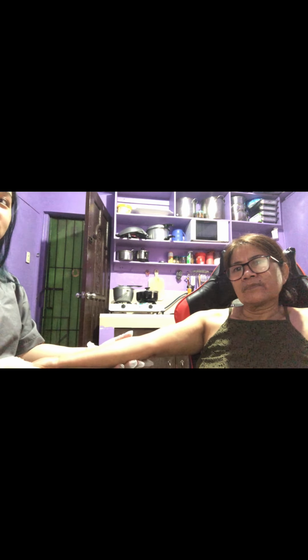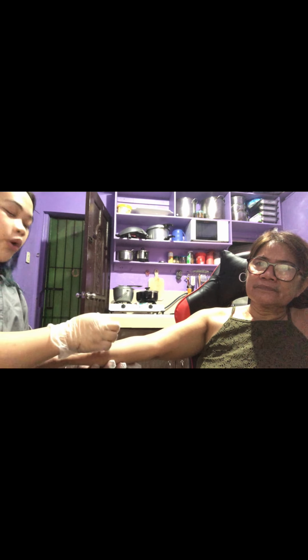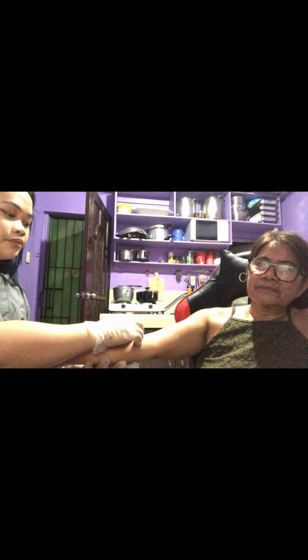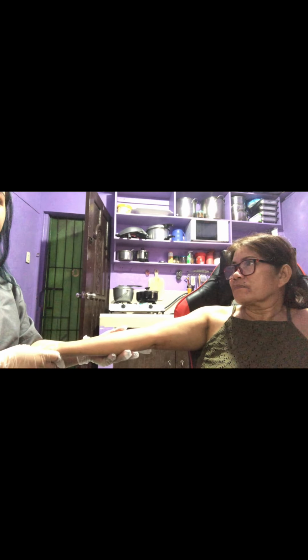So now expose the site of injection. Carefully choose an area away from the blood vessel. Disinfect the site using an alcohol swab in circular motion, working from inner to outer direction. So next, place your non-dominant hand under the patient's arm and stretch the skin out. This will tauten the skin, allowing the needle not to meet any resistance from the skin.